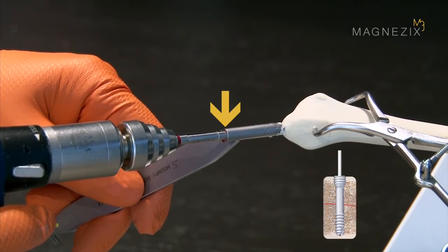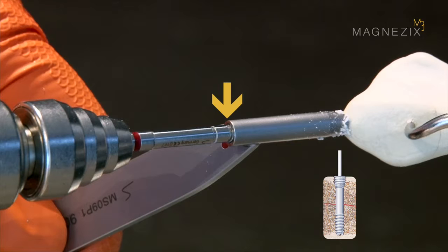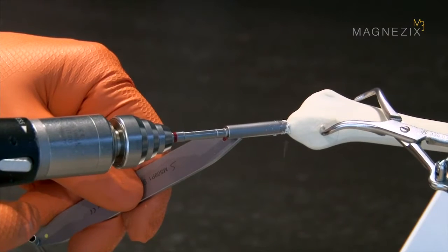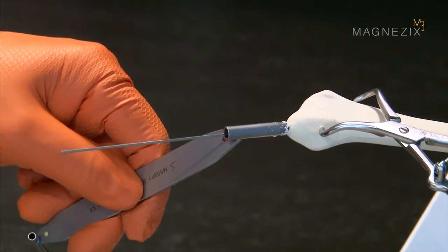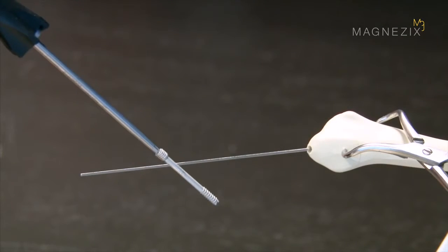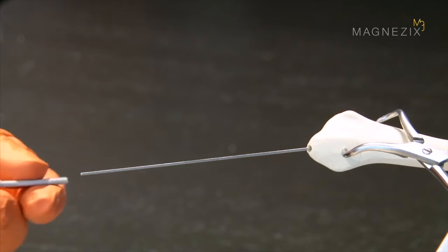If the screw is perpendicular to the bone surface, the head space only has to be enlarged to the first ring mark to ensure the screw head can be completely countersunk. If the screw is not perpendicular to the bone surface, however, the head space must be enlarged to the second ring mark to ensure the screw head can be completely countersunk. The 34mm MAGNEZIX CS 3.2 screw can now be inserted over the guide wire.